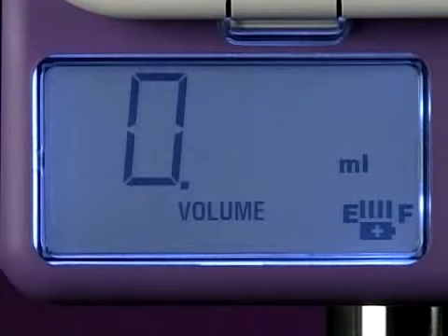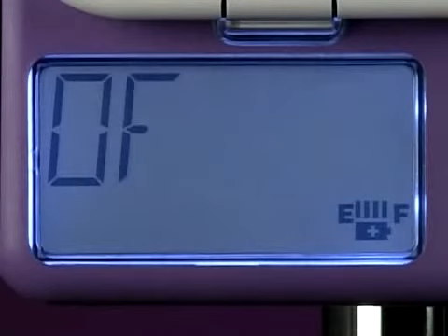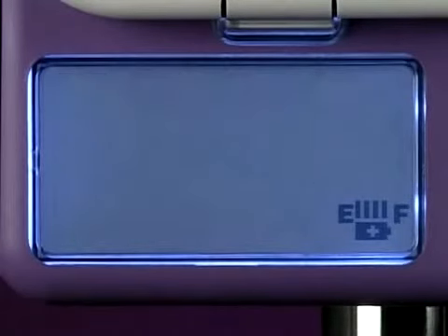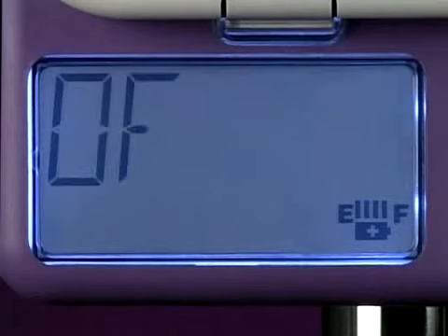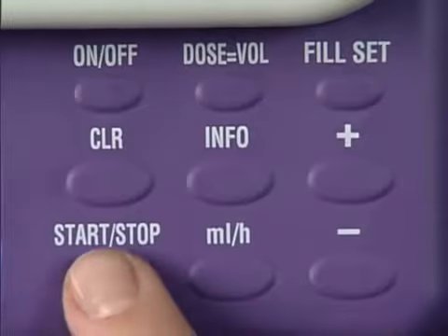The display will inform you of the pump's status — for example, fill set or end of dose. The end of dose signal sounds to notify you that the pump has delivered the preset dose. Press the start-stop key to clear it.